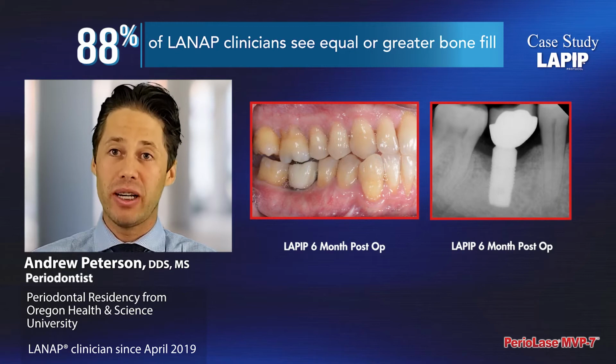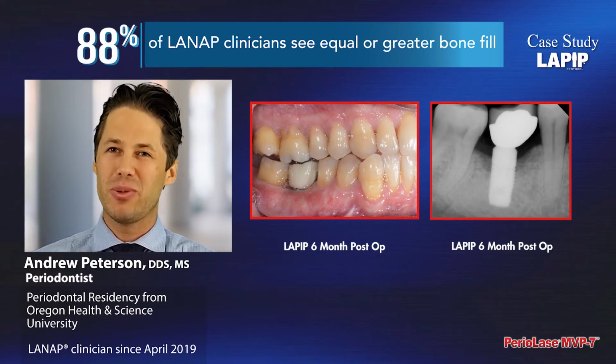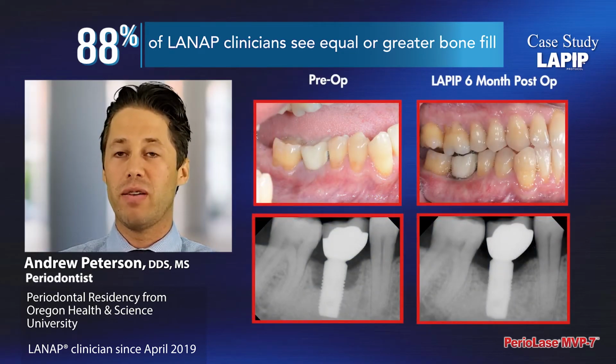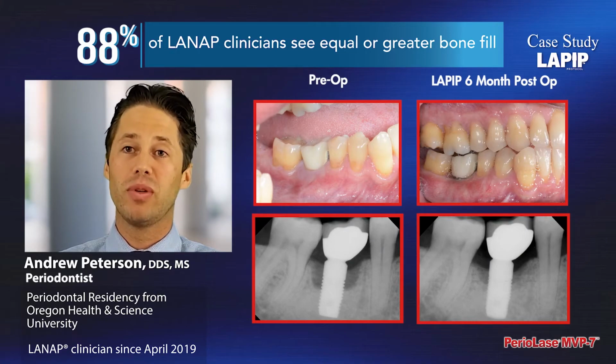And as you'll see in the radiographs, we have increased radiopacity around that implant and decreased gingival inflammation, and we also got some tissue shrinkage around that area. So the tissue is tightening up and just presented as healthy, firm coral pink tissue around the implant, including the other tissue in the lower right quadrant. At this point, we have remarkable bony regeneration around that implant, and the prognosis has improved from questionable to good long-term prognosis.